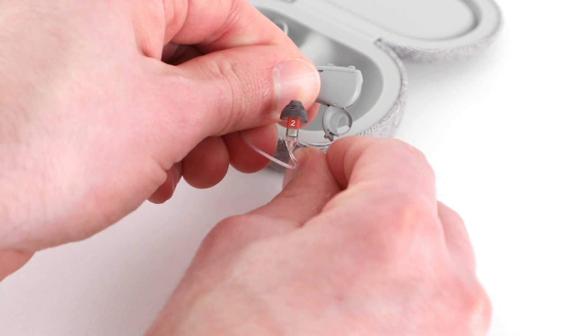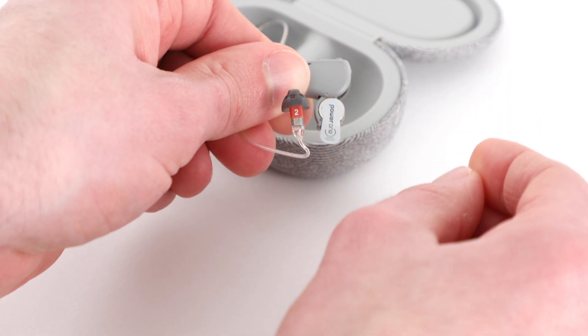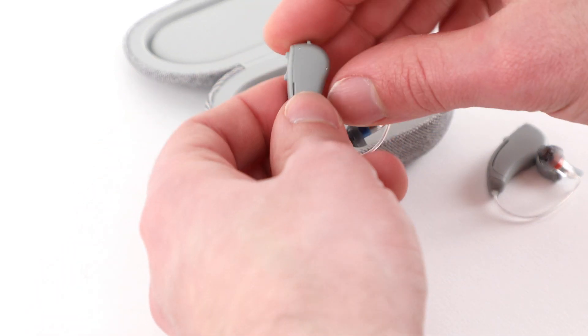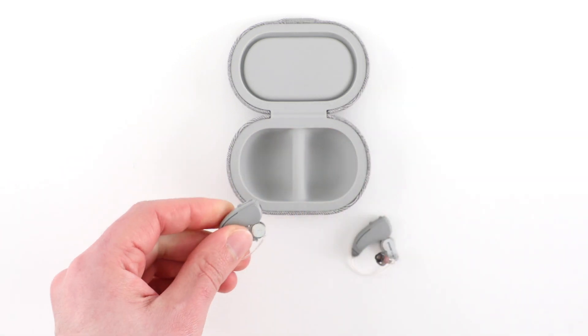Gently pull the tab on the bottom of the hearing aid until the battery door fully opens. Insert one of the provided size 312 batteries with the sticker side, or positive side, facing up. Repeat these steps for the other hearing aid.